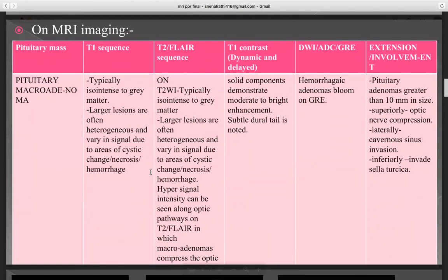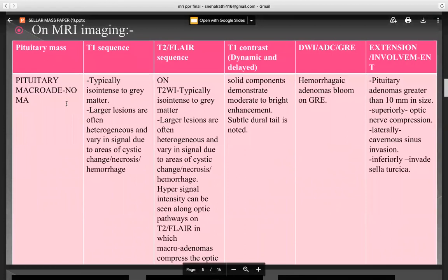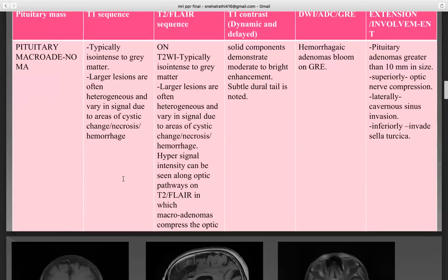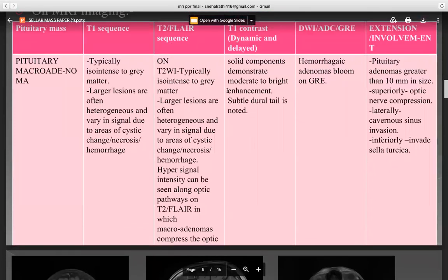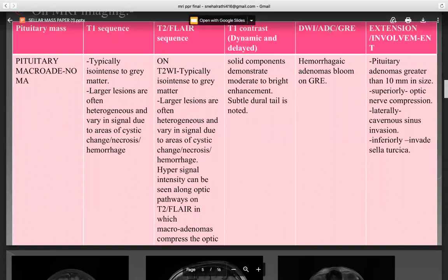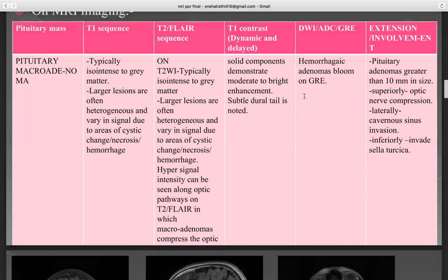On MRI imaging, first — pituitary macroadenoma. On T1 sequence, it is typically iso-intense to gray matter. Larger lesions are often heterogeneous with varying signal due to areas of cystic change, necrosis, and hemorrhage. Hyper-signal intensity can be seen along optic pathways on T2 FLAIR in which macroadenomas compress the optic nerve. On T1 contrast, dynamic and delayed, solid components demonstrate moderate to bright enhancement and a subtle dural tail is noted. On diffusion-weighted ADC and GRE imaging, hemorrhagic adenomas bloom on GRE.